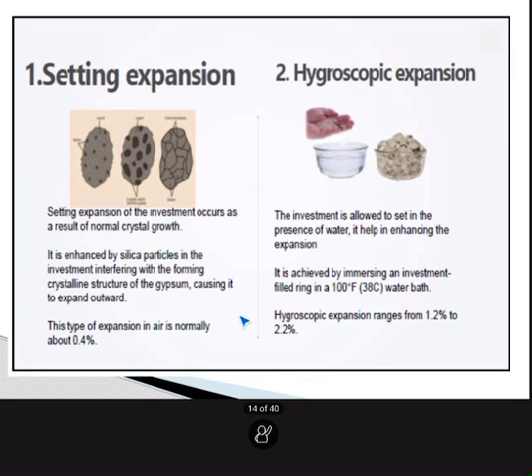Setting expansion of the investment occurs as a result of normal crystal growth in your investment material, and it is enhanced by silica particles in the investment interfering with the forming crystalline structure of the gypsum, causing it to expand outward. So there should be some silica particles in your investment material. This type of expansion is normally only 0.4%, but it should be there so that it will compensate some of the solidification shrinkage.